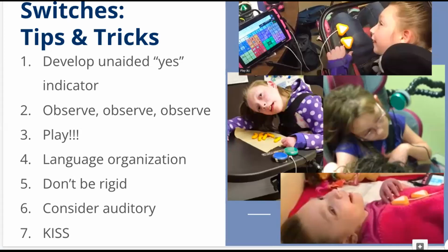Later on, when I go into mounting, again, we can keep it simple with our mounting. A lot of times, if it's possible and I'm using an arm for the communication device, and this is a person that uses their hands, I will mount the switch right to the arm for the communication device. That way, it's one thing you put on the chair when you're getting set up in the morning versus two. Anything we can do to make any bit of the day more efficient and simple, the better.